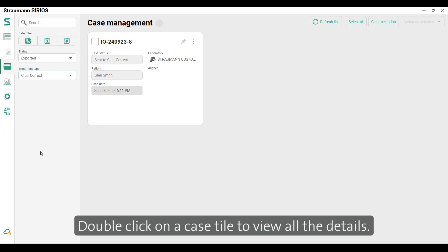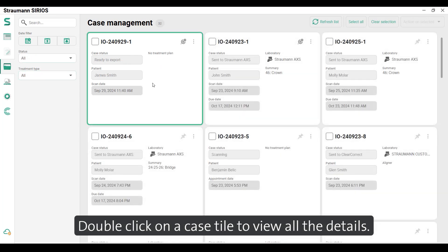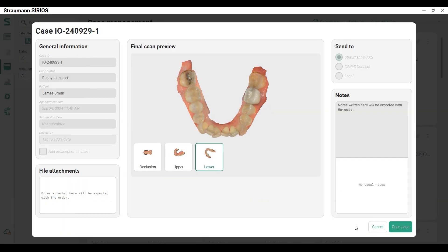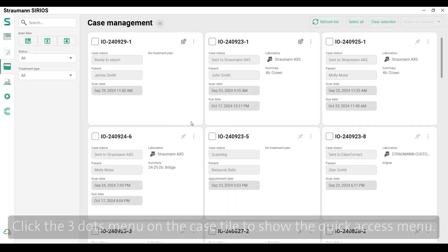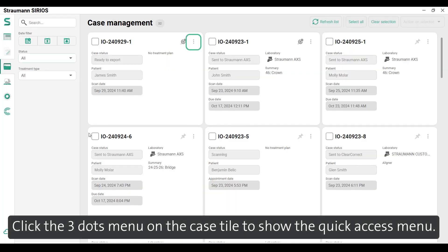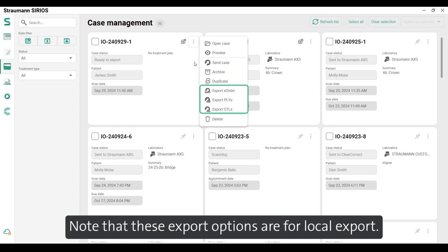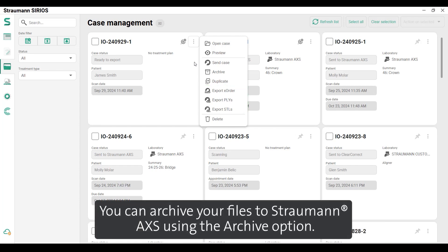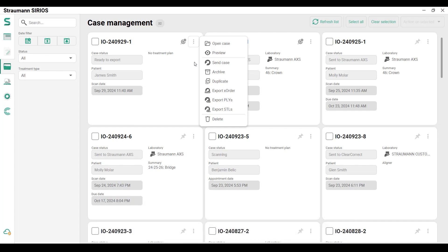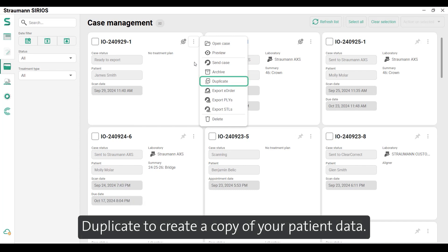Double click on a case tile to view all the details. Click the three dots menu on the case tile to show the quick access menu. Note that these export options are for local export. You can archive your files to Straumann Access using the archive option.